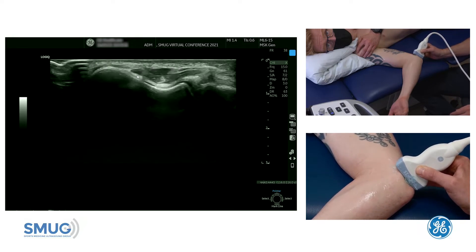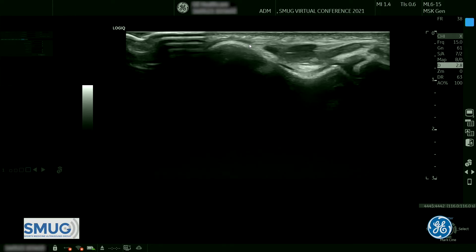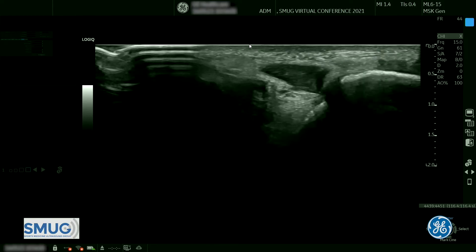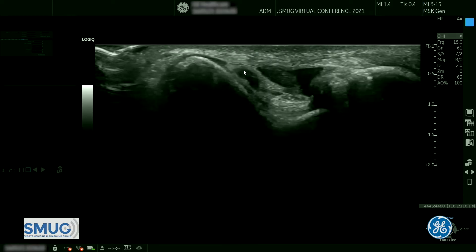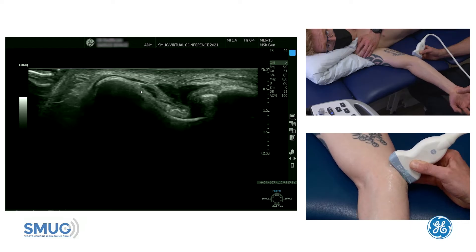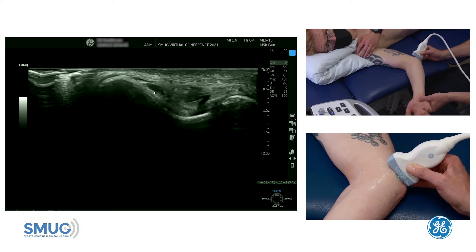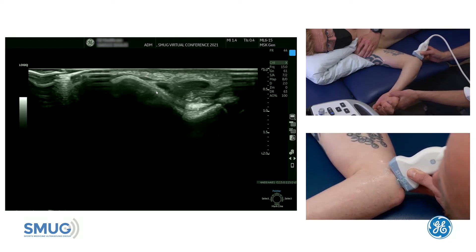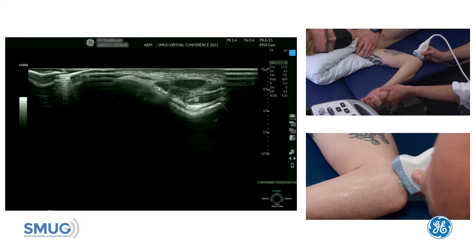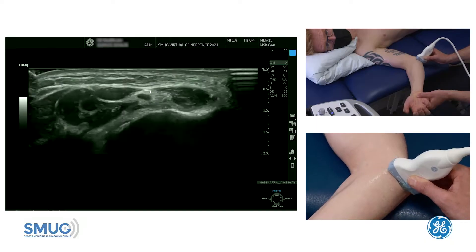To carry out a maneuver to see if there's any subluxation, it's really important to keep the medial epicondyle in view — keep that mountain high. What we do is go into full extension, keeping that mountain up, and you can see the ligament over the top. Then we go into full flexion, keeping the mountain high, and see whether or not it rides up.